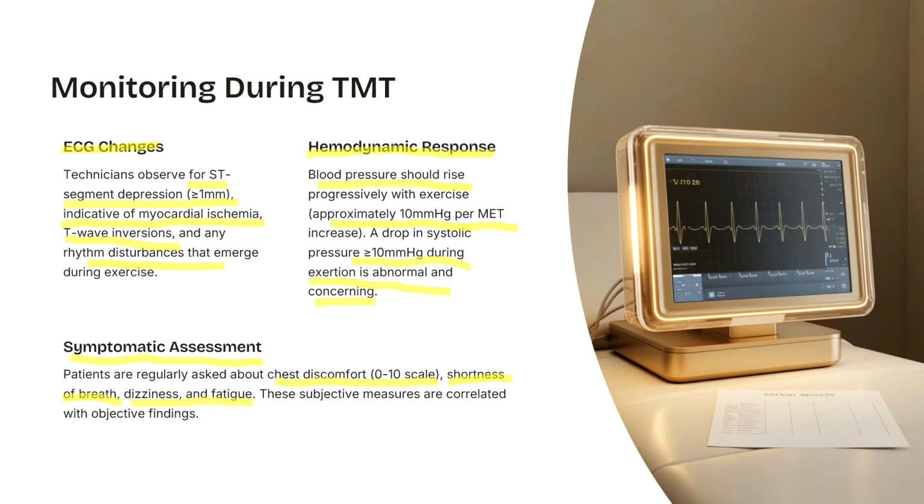So three things are to be monitored in a very minute way during the TMT exercise. Number one is changes in the ECG, and there the ST segment and T wave are the main things to be monitored. Then the hemodynamic response, then the symptomatic assessment.